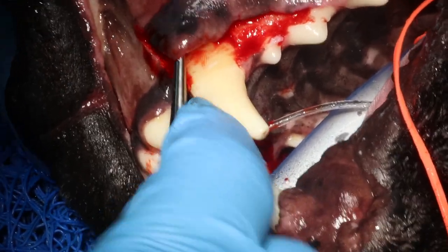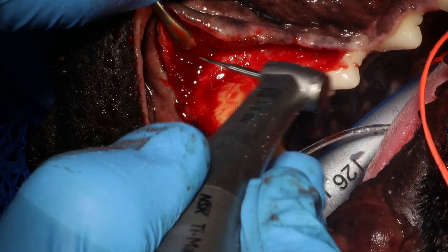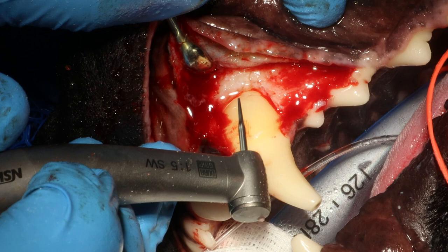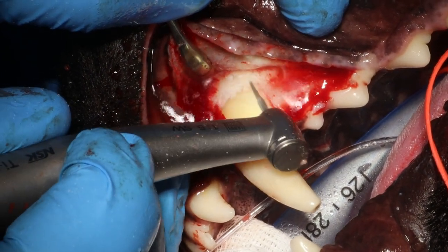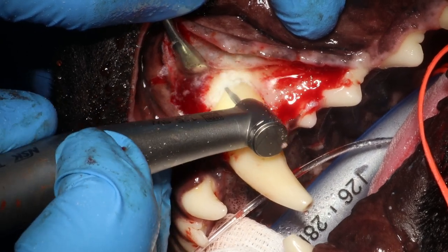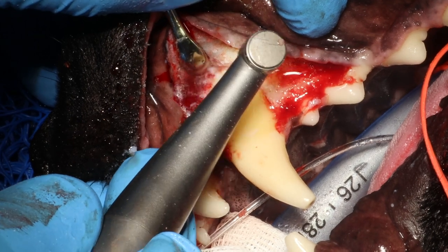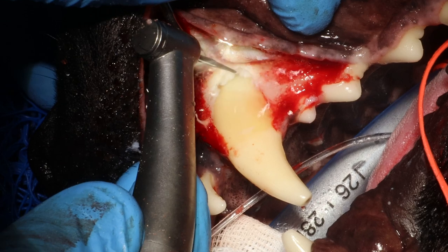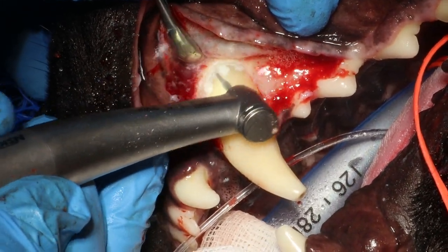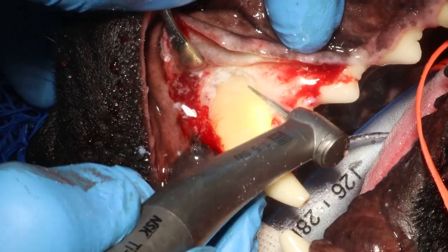Here I felt the flap was a little bit too tight, so I loosened it a little to be able to remove even more bone, because this is a very long root. This bone right here is usually not this thick, but this tooth had a periapical problem — there is a lucency, likely a cyst, abscess, or granuloma. These are histological diagnoses, so you are never really sure which it is. In this case it is probably a cyst due to chronic irritation.